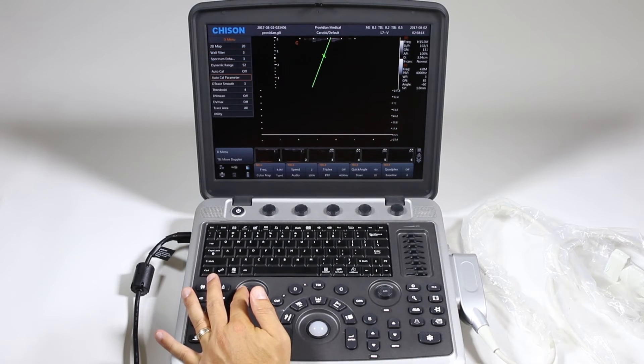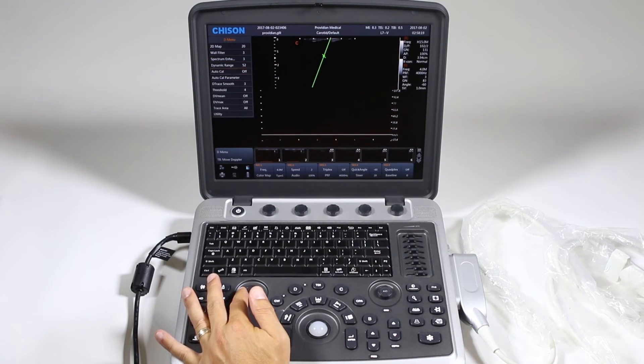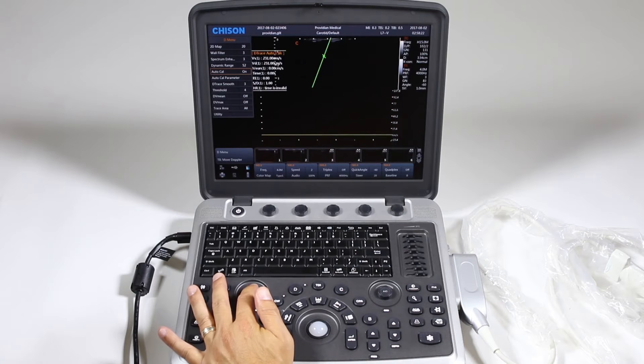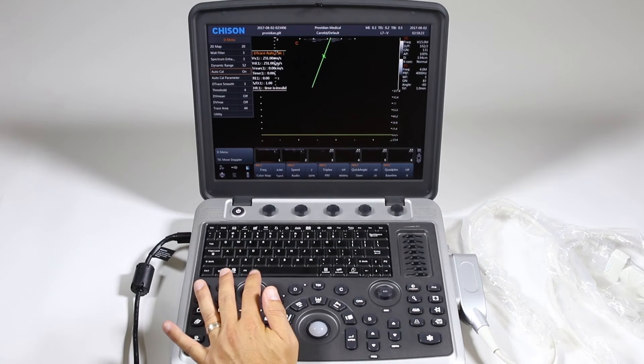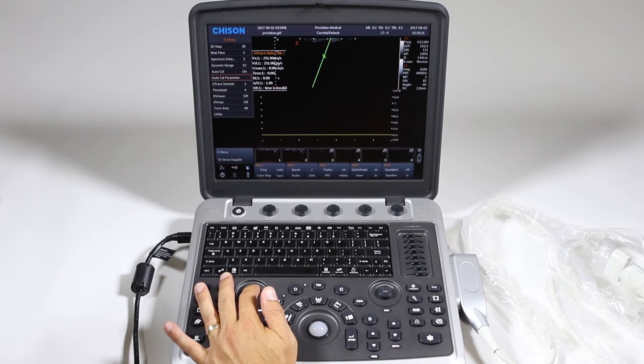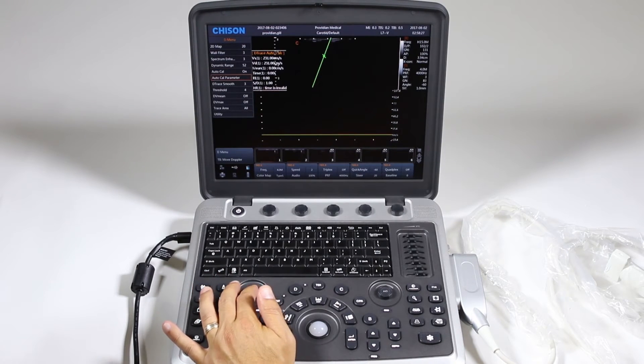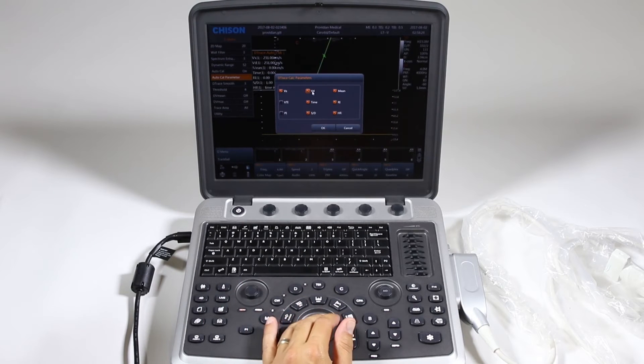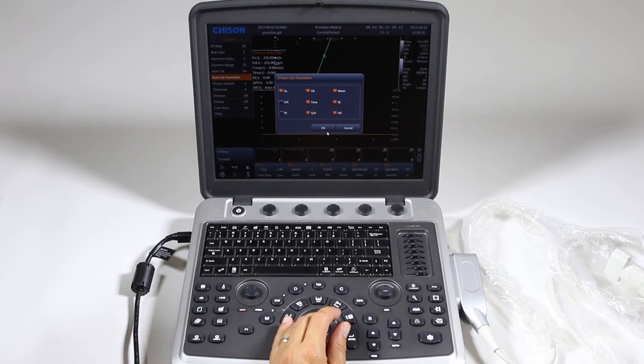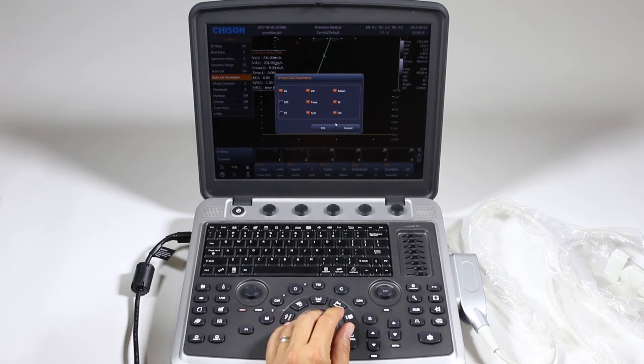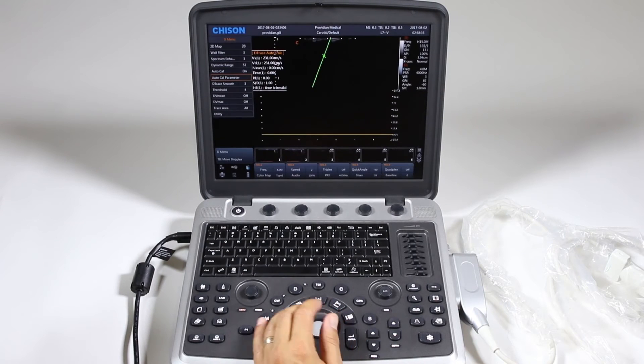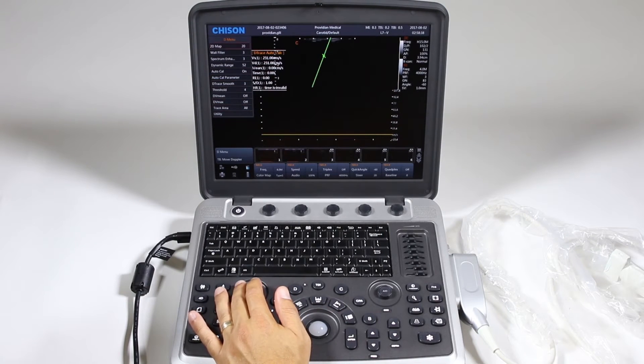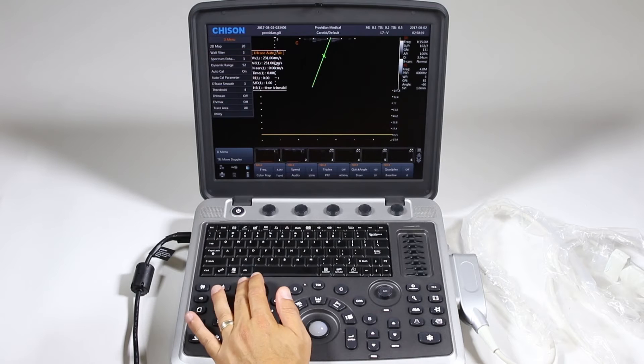And then you have other items: spectral enhancement, auto-calculations you can turn on and it'll show you those calculations live. Auto-calc parameter, you can check these off as to what it is that you'd like to see in this auto-calc that shows up. Smoothing trace, threshold for it, various things here.